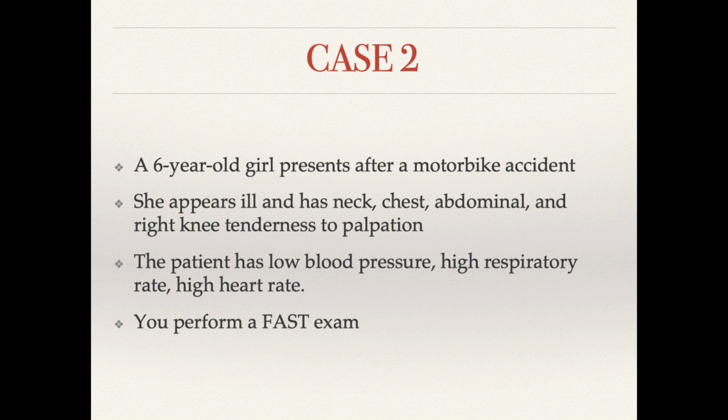Let's move on to case number 2. A 6-year-old girl presents after a motorbike accident. She appears ill and has neck, chest, abdominal, and right knee tenderness to palpation. The patient has low blood pressure, high respiratory rate, and high heart rate. You perform a FAST exam.